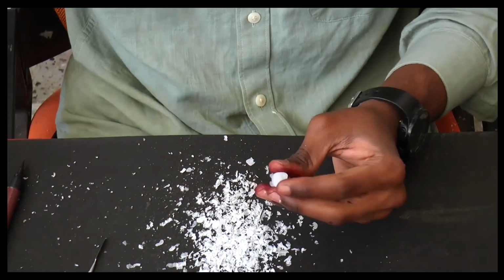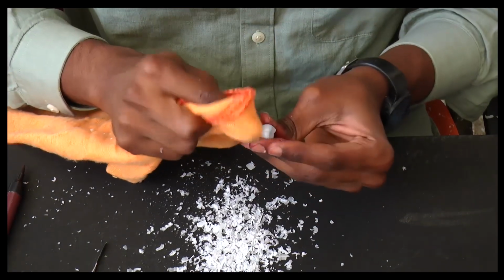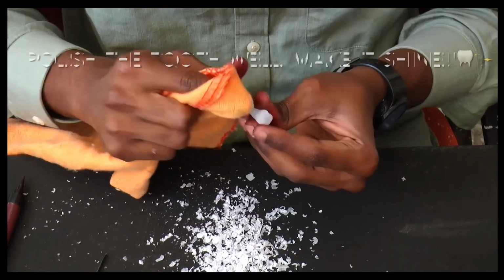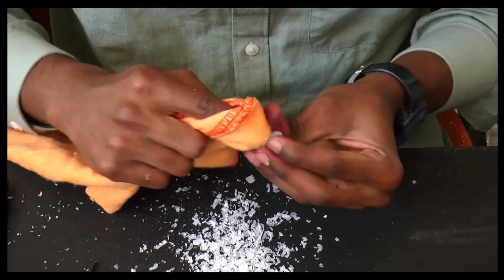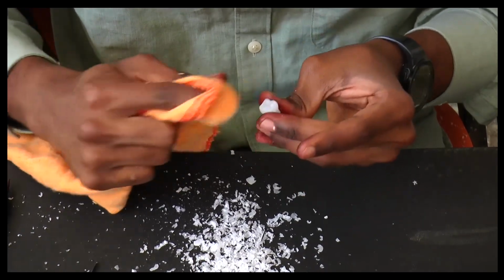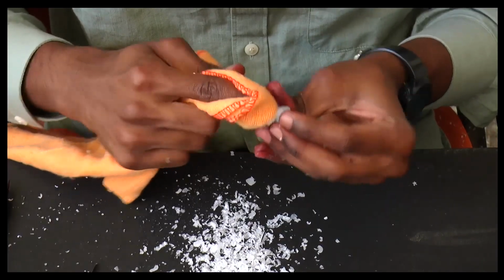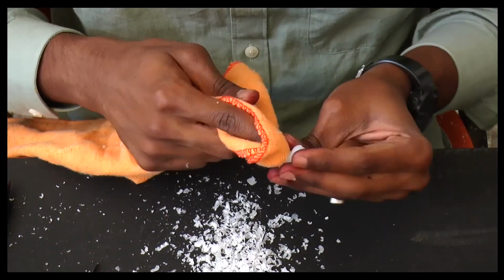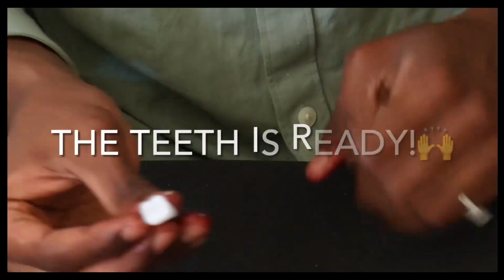The last step, which is very important, is to take our polishing cloth and polish the entire tooth. Our tooth is ready.